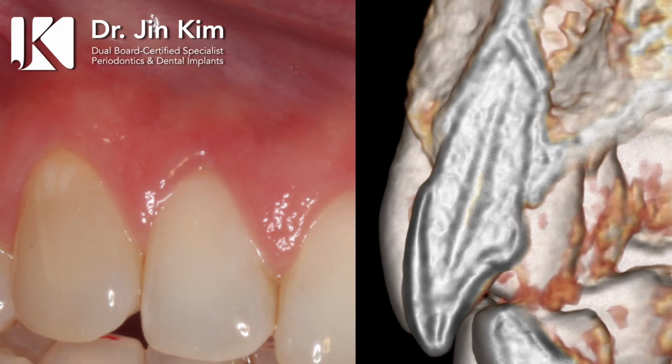And the next view is the tooth in front. I have a cross-section of the tooth, which is a lateral incisor, which is in the center of the clinical picture. But the cross-section of the CBCT, the three-dimensional x-ray, tells its own story. Not only is the root short, but the amount of bone that remains is very, very limited, therefore adding to the anxiety of how long this whole situation is going to last.